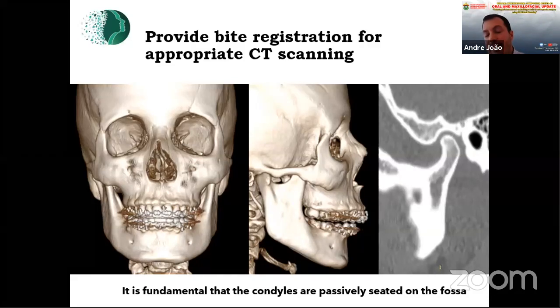It's made of wax, a hard wax that we need to manipulate with warm water, so it doesn't cause deformation or change quickly.